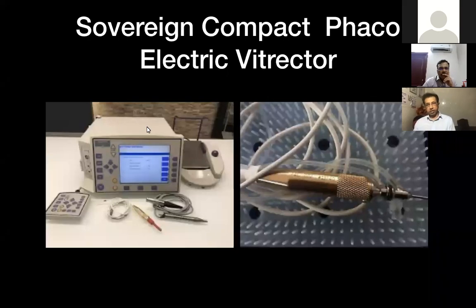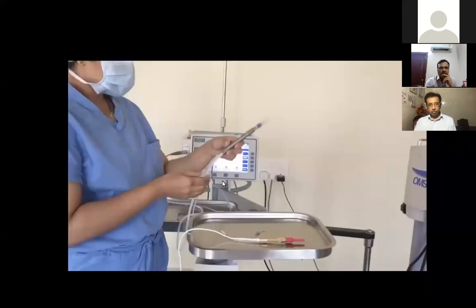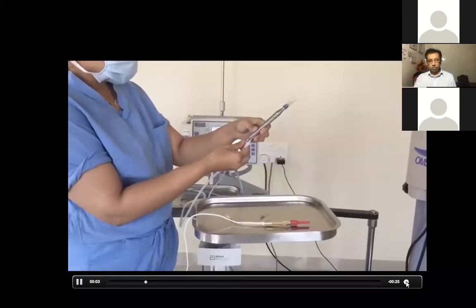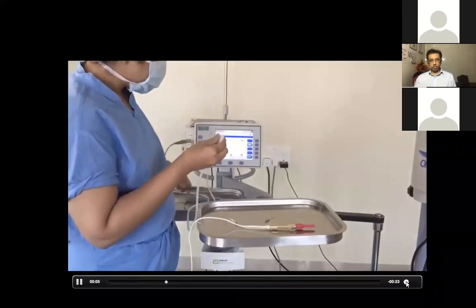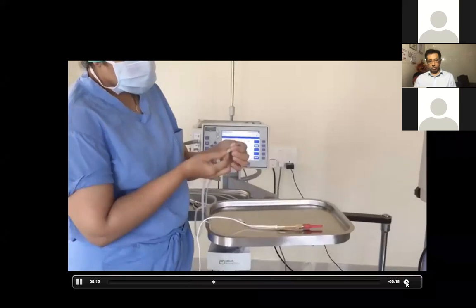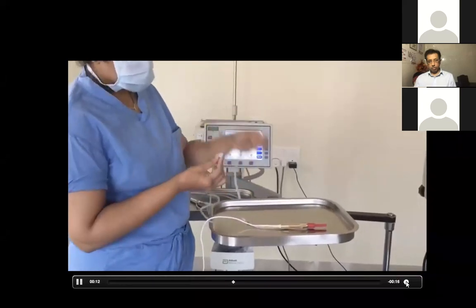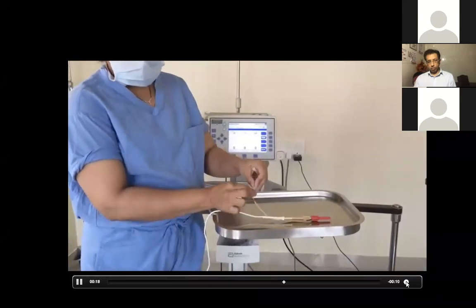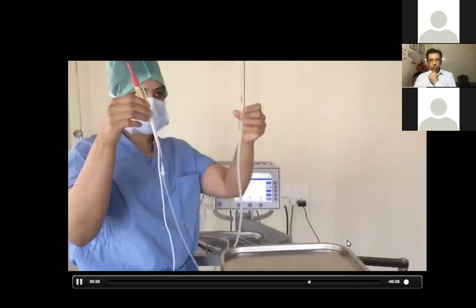With the Sovereign Compact machine, that comes along with the machine, so we just have to plug in the vitrectomy port and switch it to vitrectomy mode, and disconnect the irrigation and aspiration from the phaco. The irrigation is connected to the 23-gauge cannula or phaco cannula, visco cannula, and then the aspiration is connected to the vitrectomy probe — the aspiration port of the vitrectomy port.